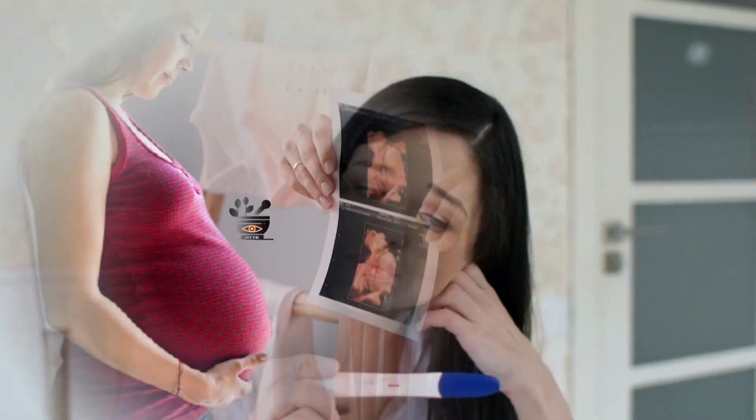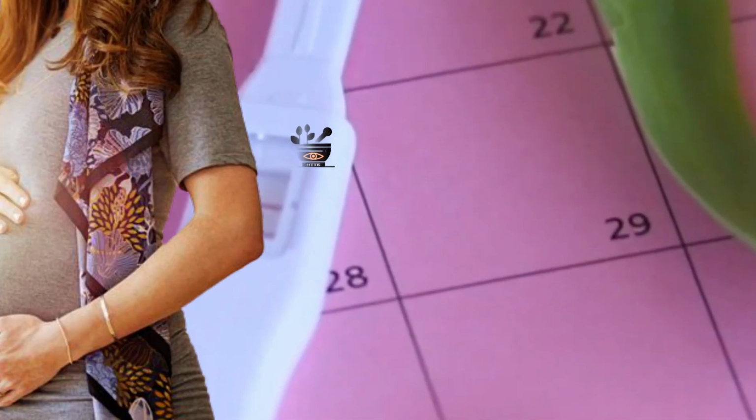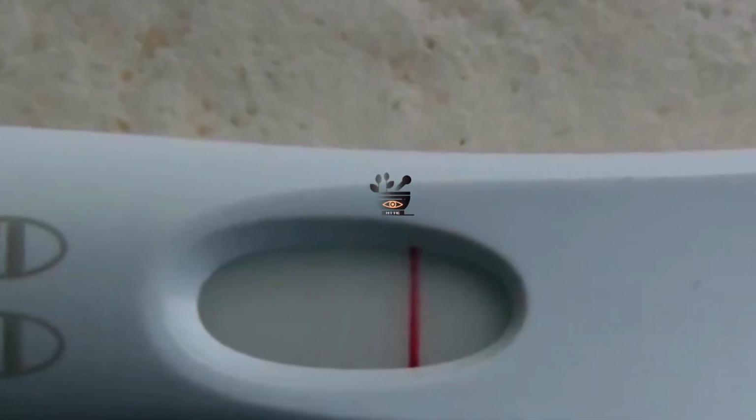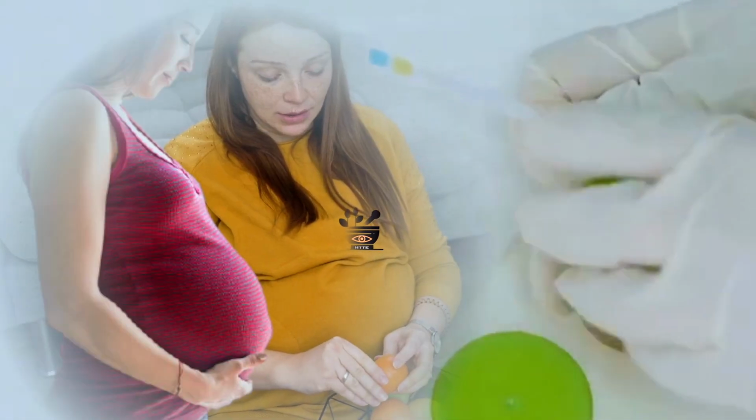However, there are two types of faint lines you might encounter. The first type is a positive pregnancy test with a very faint line. This indicates low levels of hCG, the pregnancy hormone, in your urine. It's important to note that this faint line appears within the time frame mentioned in the test instructions. The second type is an evaporation line that only becomes visible after the designated time frame. Imagine you've taken the test, waited for the recommended time, and found a negative result. However, if you let the test sit for longer, you may notice a faint line. This is an evaporation line and does not indicate a positive pregnancy.